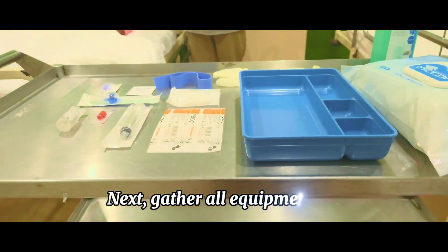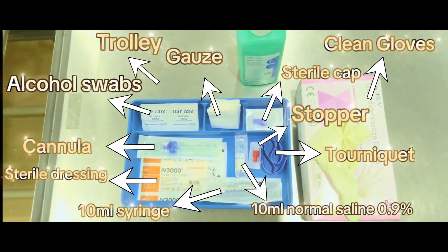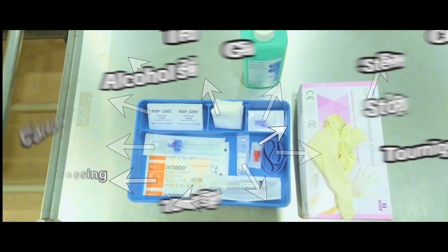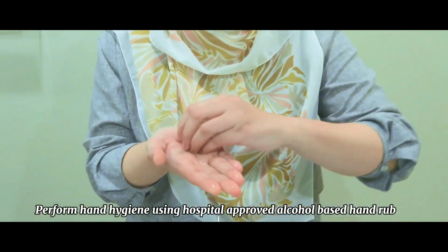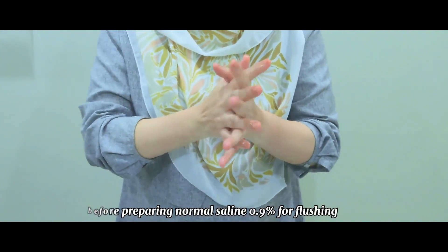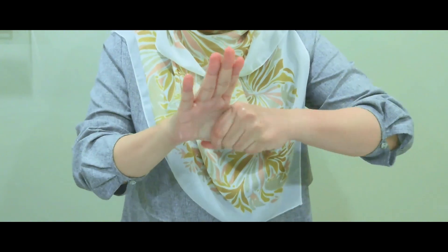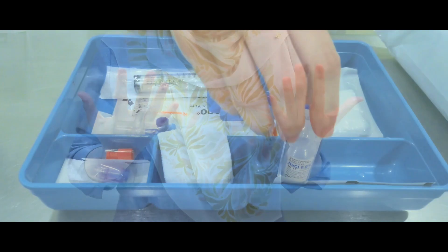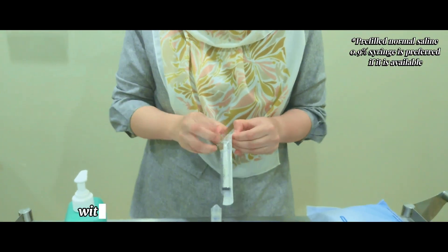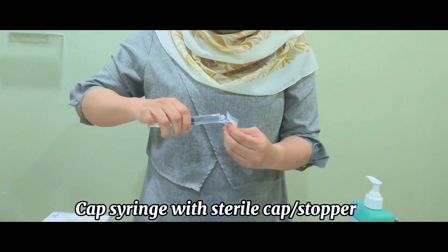Next, gather all equipment. Perform hand hygiene using a hospital-approved alcohol-based hand rub before preparing the flush. Prepare normal saline 0.9% for flushing using a 10 ml syringe with aseptic non-touch technique (ANTT). Cap the syringe with a sterile cap or stopper.